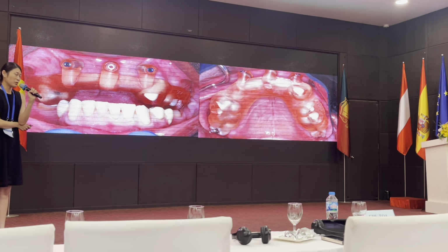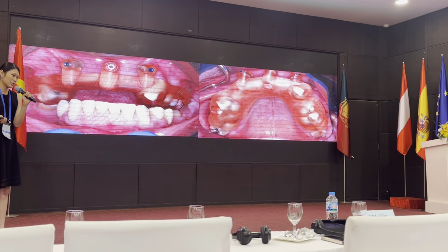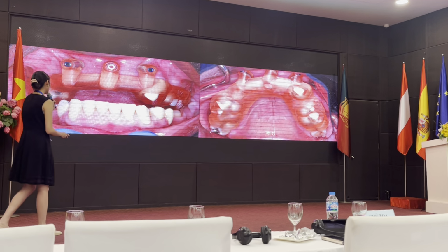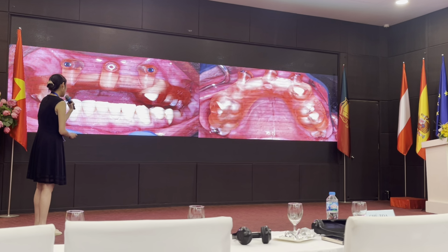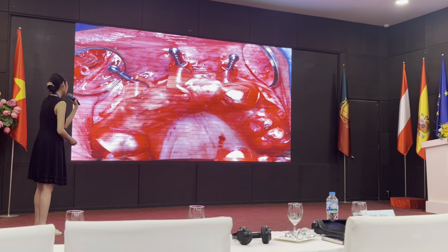So the first thing, before you do anything, you want to make sure the patient's periodontal condition is really stable. So before we jumped into the surgery, we had gone through phase 1 therapy for 3 months before we did anything. And then we tried on our tooth-supported guide, and it fit quite well. And then we went on to raise the flap.